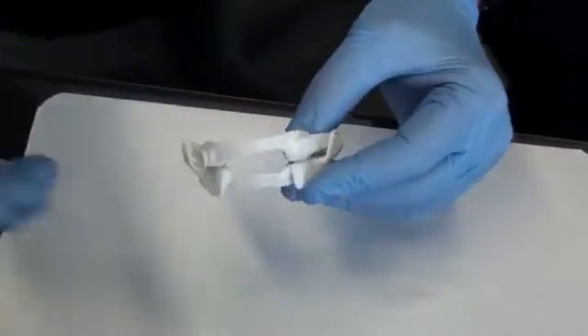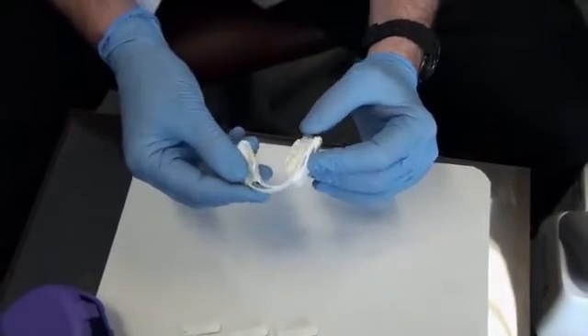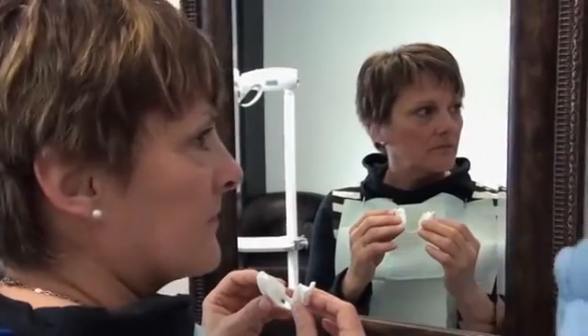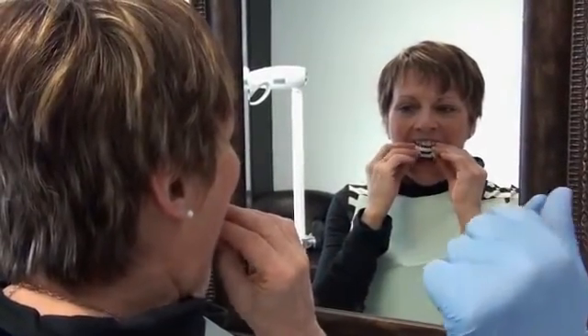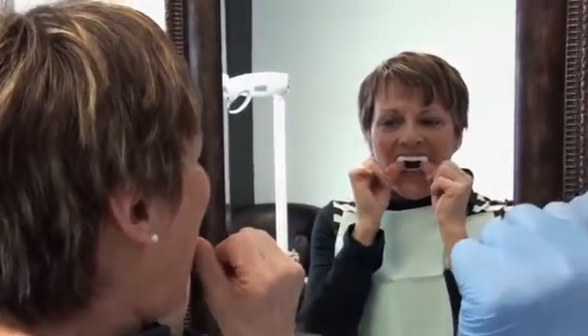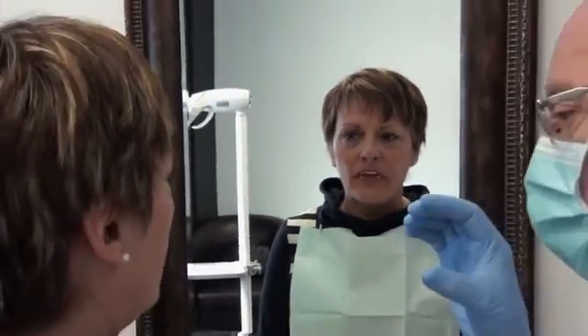The device will now be inserted in the patient's mouth, and we will show her how to insert it by herself. To the patient: you will place the whole device in your mouth. Place your thumbs under the upper part and clip it to the upper teeth. Once you feel it is secure, hold your cheeks with your two index fingers and slowly move your chin forward. You then bite into the device. Keep your lips parted and bite. Are you comfortable? Yes. The device is properly inserted. Open your mouth, close it — only part your lips and keep your teeth closed together.